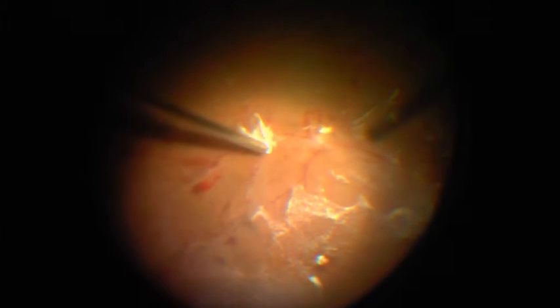This is possible because the 27-gauge cutter has a very small cutting port which sits right at the end of the tip, and coupled with the very fine form factor of the entire instrument, it makes it possible to reach right up to the tissue without causing any turbulence due to the very fine fluidics involved in a 27-gauge cutter, which has an actually even thinner 30-gauge inside. This is the reason why I personally prefer 27-gauge vitrectomy even in these complicated cases where we have to do a lot of tissue handling.